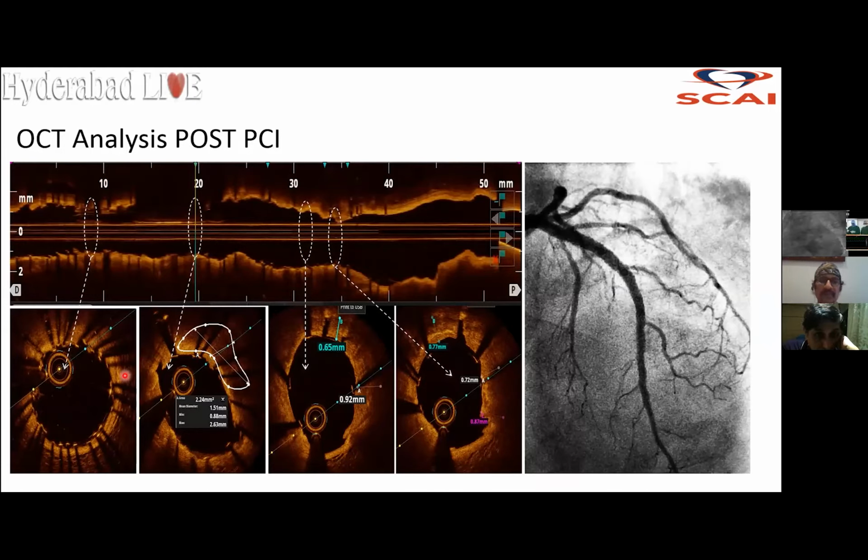In fact, following stent placement, if you see a particular area not expanded and you see lots of calcium behind, there could still be some options available to you today to go in and correct the under expansion then and there. Never leave an under expanded stent.